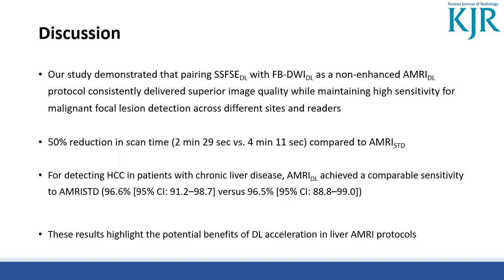Our study demonstrated that pairing deep learning SSFSE with deep learning free-breathing DWI as a non-enhanced AMRI protocol consistently delivered superior image quality while maintaining high sensitivity for malignant focal lesion detection across different sites and readers. Additionally, we achieved a 50% reduction in scan time compared to standard AMRI. For detecting HCC in patients with chronic liver disease, deep learning AMRI achieved a comparable sensitivity to standard AMRI protocol. These results highlight the potential benefits of deep learning acceleration in liver AMRI protocols.